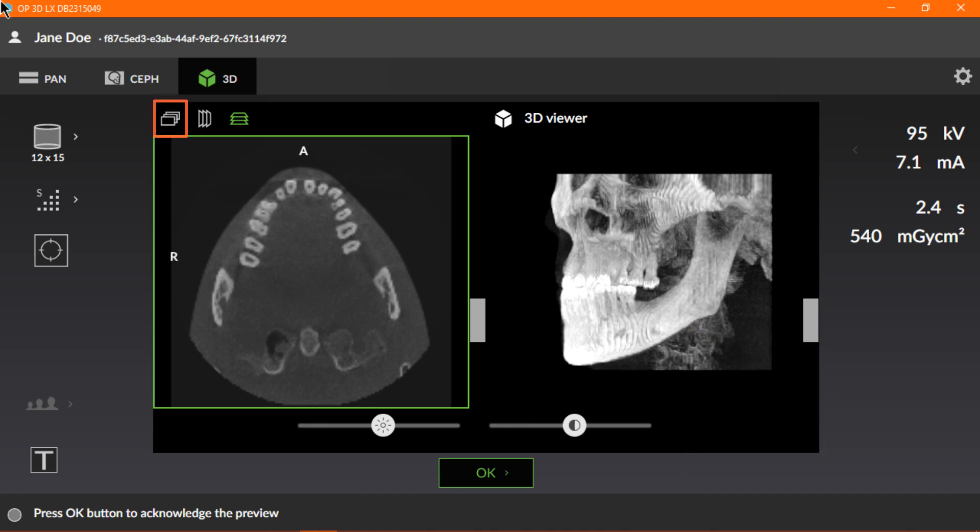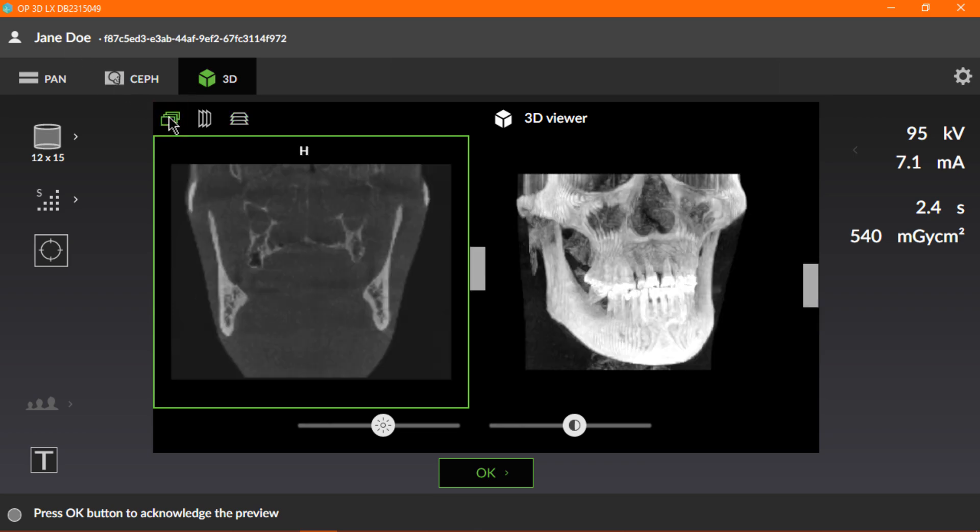Click the first slice preview projection icon to display the coronal view. Here, we'll see H, which indicates the head-foot view.